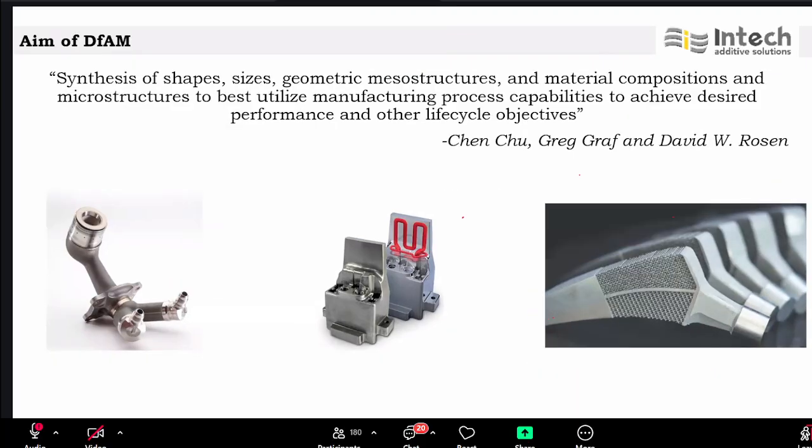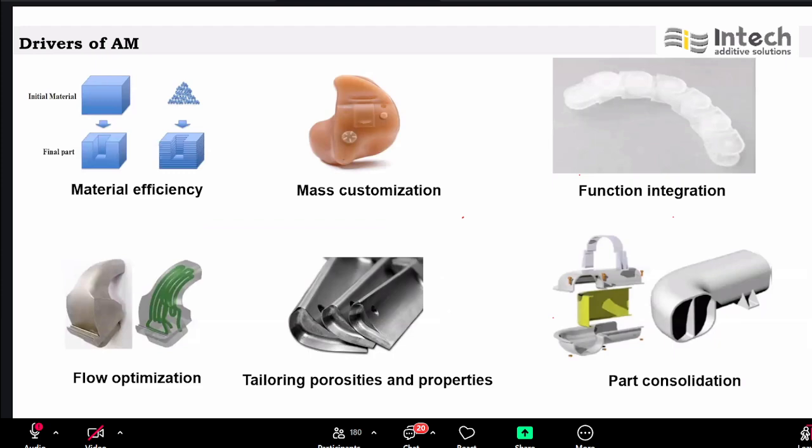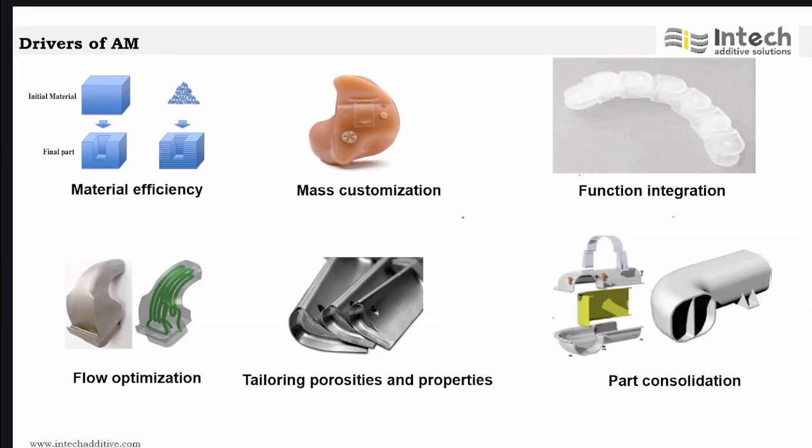So, what are the drivers of the additive manufacturing process? We have material efficiency. You can see that you can eliminate a lot of waste. So it's a direct reduction in the material cost and also the waste disposal cost.